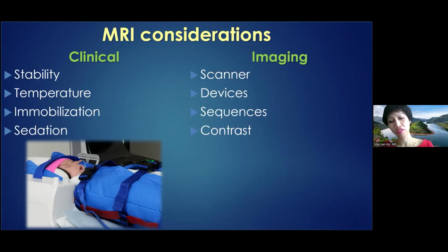So they can actually be on the floor in the NICU, right? And even if they have some lines and tubes, they may still be safe enough to not deviate within the scanner. But obviously, you need to work with your MRI safety people and do testing and all of this because these are more non-standard devices. But the idea is that if the baby's not stable enough to be taken all the way down to radiology and MRI, some of these units are more point of care and may allow for more real-time scanning.